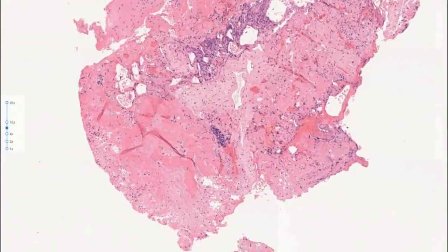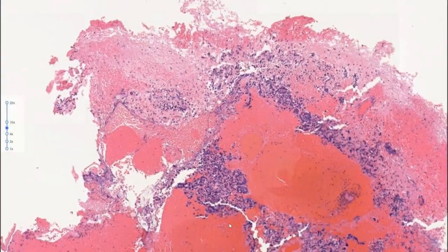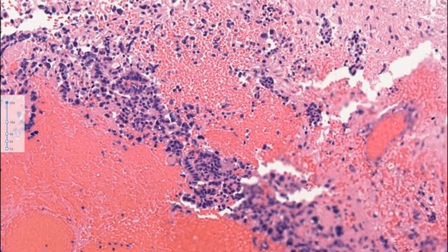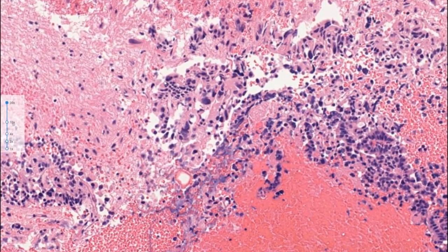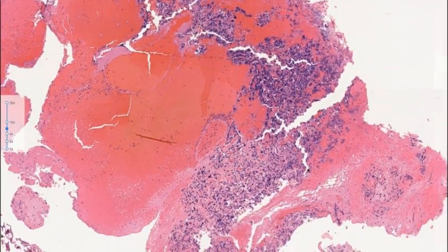And again, we have something here. You argue that there's some gliosis, and you have a tumor that is papillary as well. What is striking here is that you have a more pronounced variation in nuclear size and hyperchromasia.